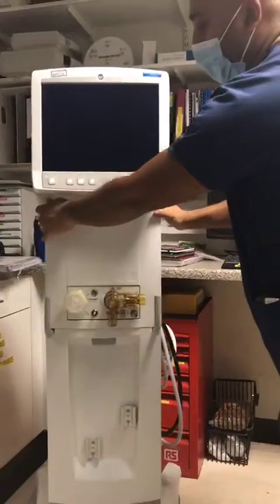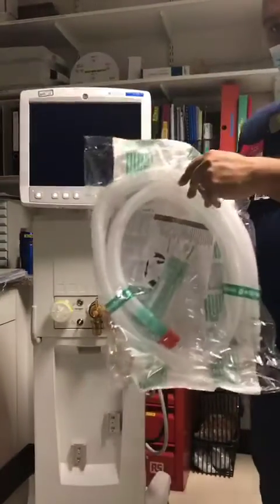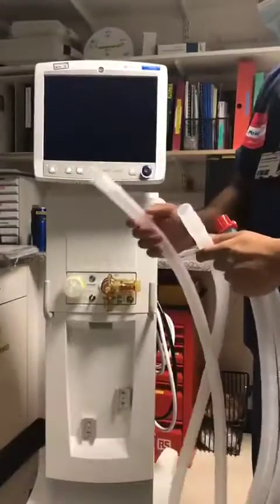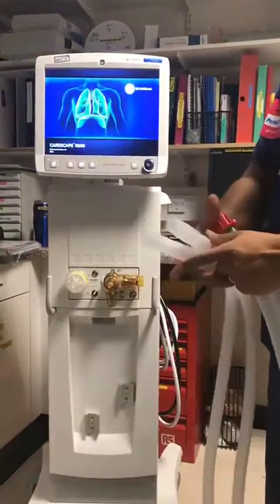While the ventilator is doing a self-check, you can get your circuit and fit it to the ventilator. Just put the tubes in the inspiratory and expiratory ports, like so.